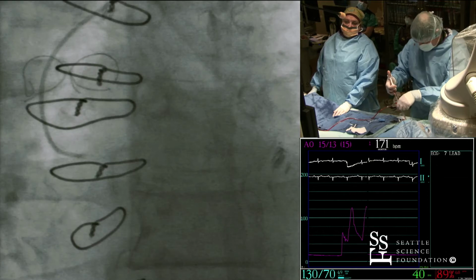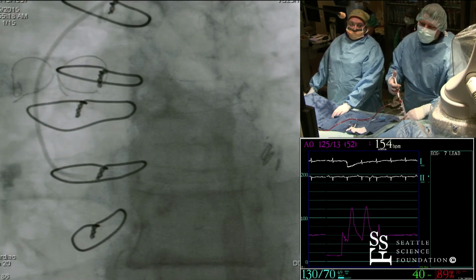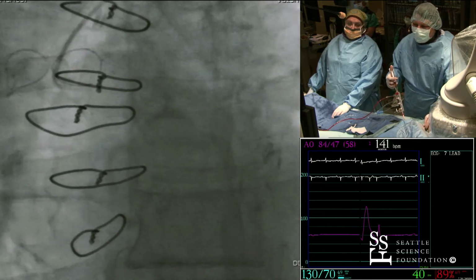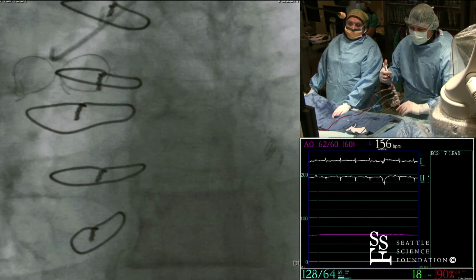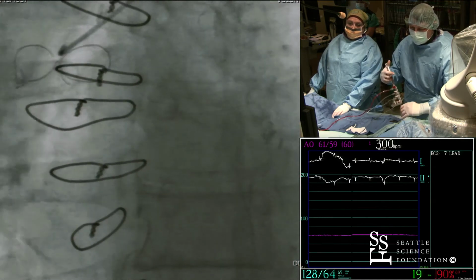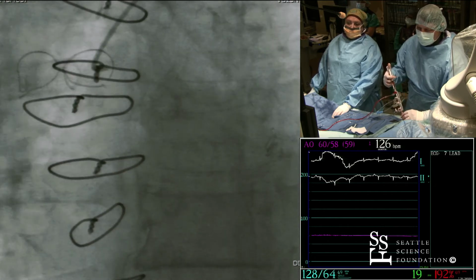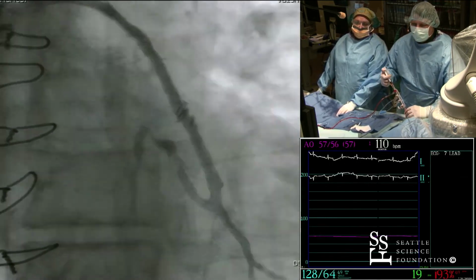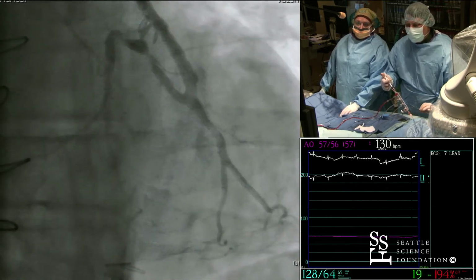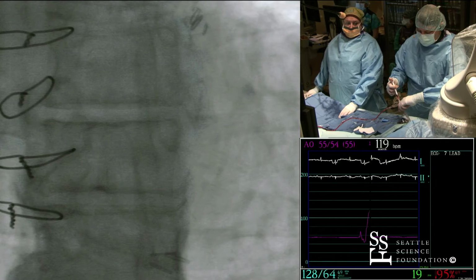But a left coronary bypass is really common. It's a little bit difficult from the left to get over to the anterolateral aorta. There, that's probably in. That's working pretty good. Okay. That looks nice, the graft looks pretty good. That's his circumflex graft.